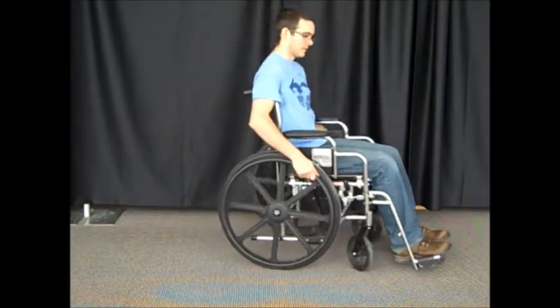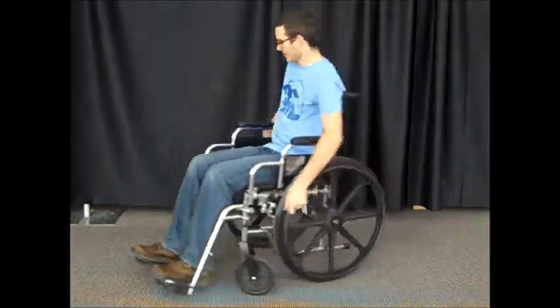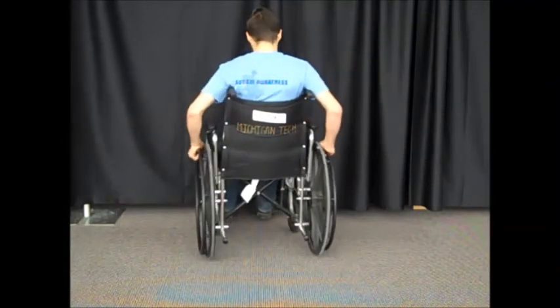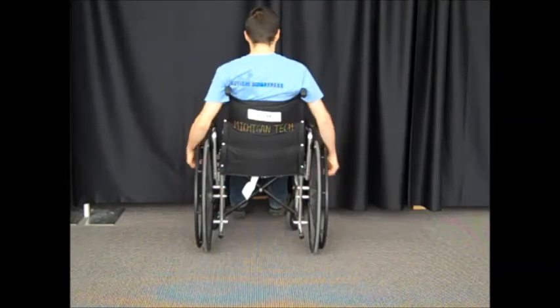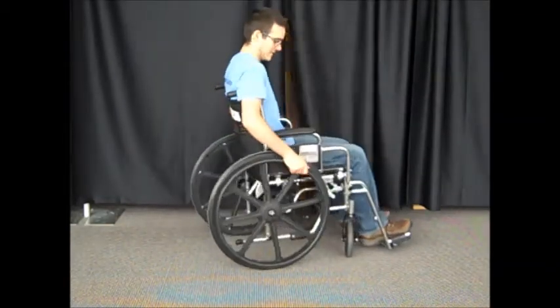The gap between the driving wheels and the torso should be as narrow as possible to allow maximum propulsion efficiency, and keep the arms in a more neutral position, which decreases strain on the upper extremities. Here you can see an example of a wheelchair that is too wide for the user.